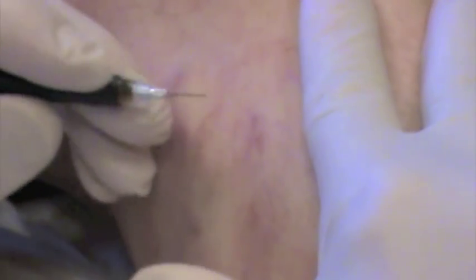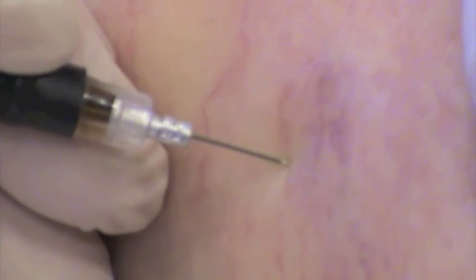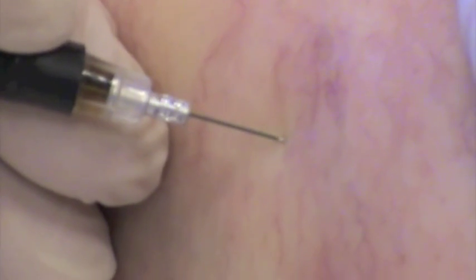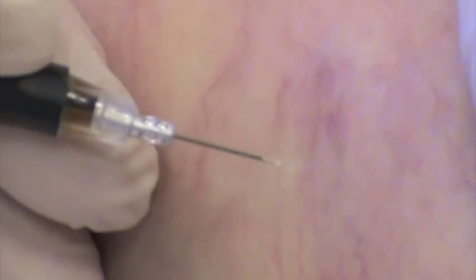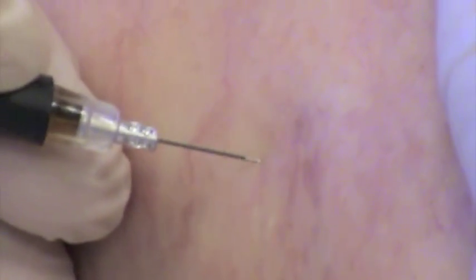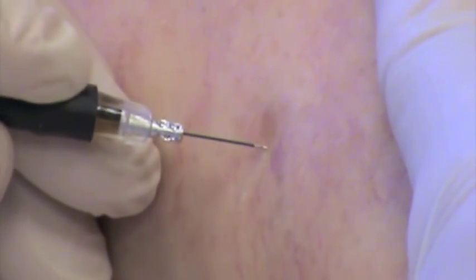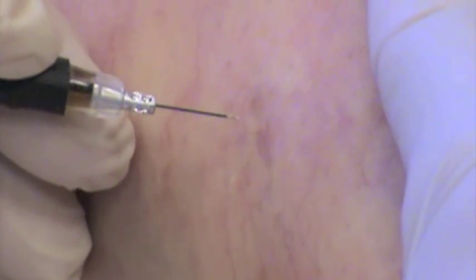When you actually do this procedure, you place the needle perpendicularly, and as it fires you insert it. These are more superficial veins, so you really don't have to worry too much about going deeper. The needle is barely in here — these are probably about 200 microns deep. You can see nice fading. I see this little area puckering by the needle, so I put ice on a little bit longer.